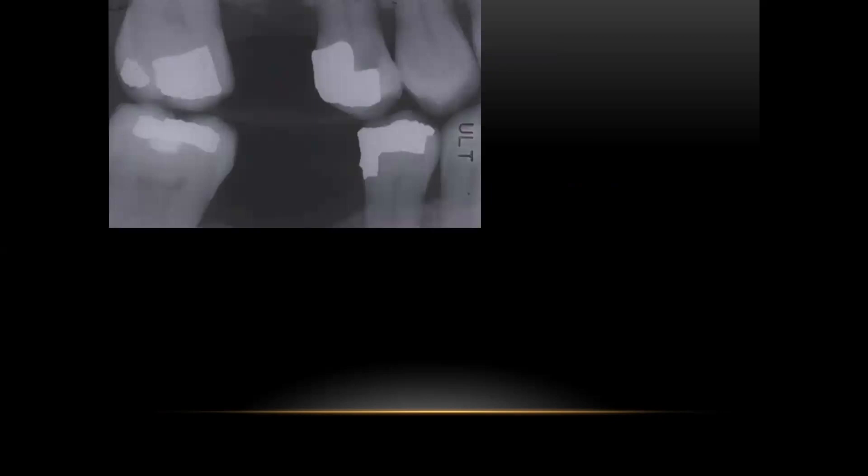This is a case that I did in my office. If you look carefully, you can see that we're going to do a fixed bridge from this premolar back to the molar, and a fixed bridge on the lower opposing it. If you look at tooth number five, you may notice a little bit of radiolucency here and a big radiolucency underneath that DO amalgam. So we're going to open this tooth, clean it out, and build it up with a base. In the meantime, we have access to that distal surface so we can check it.